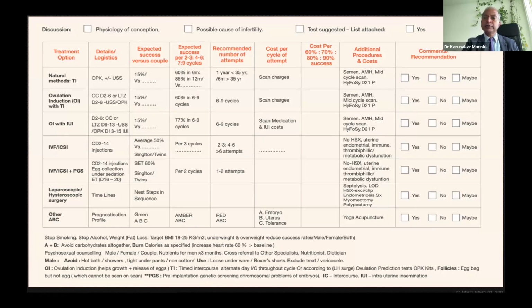So whatever nature is doing, if you can learn it and implement it in an IVF lab, which is nothing but the fallopian tube. If you can replace everything the fallopian tube has done, the egg and sperm meeting and fertilizing and becoming a blastocyst and hatching is taken care of. But then the uterus has to be normal, the soil has to be normal, the living room has to be normal. So I say use this ultrasound with 90% authentic information. If you say it's adenomyosis, it should be 90% authentic. If you say myometrial pathologies, endometrial pathologies, Doppler pathologies, ovarian reserve problem, PCO, whatever diagnosis you make with your ultrasound, it should be 90% accurate.